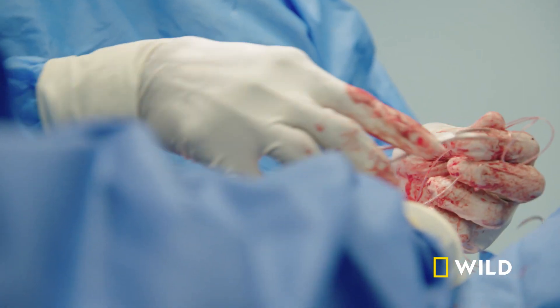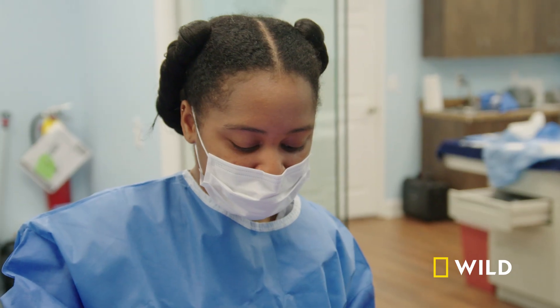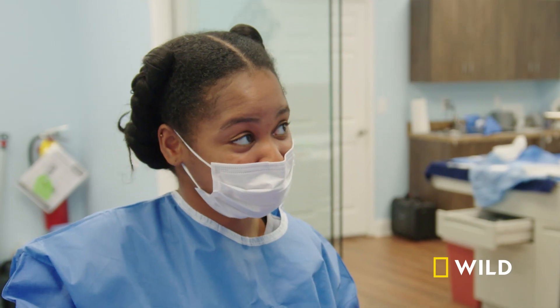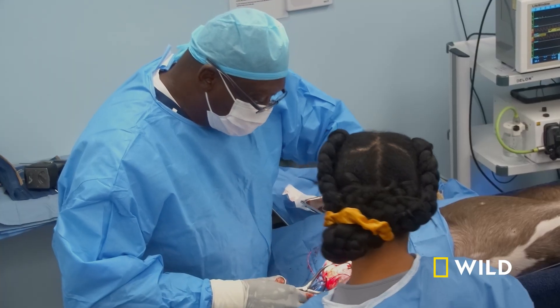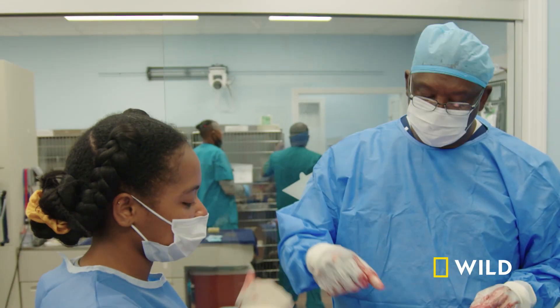We've got to get some suture back there. What are we gonna anchor it to? The fabella — that's right. So that feels good, right? Feel tight? Your first ACL. Good job. Thank you.